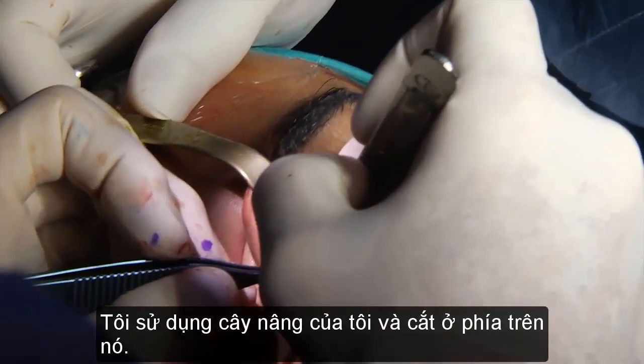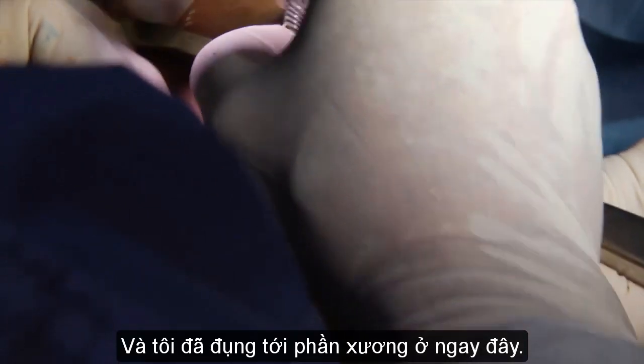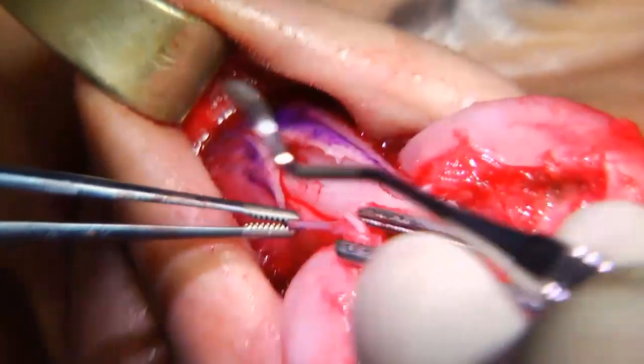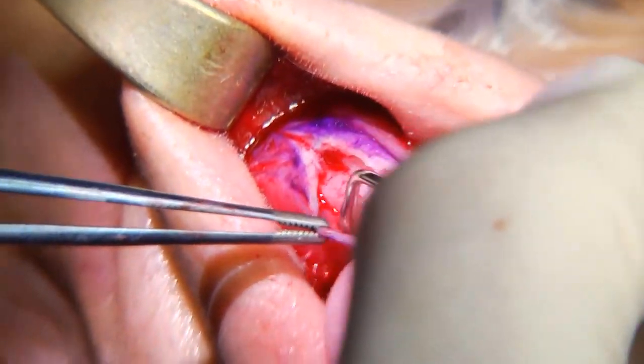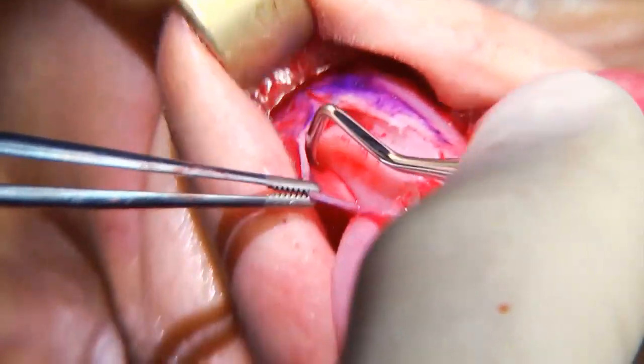So I'm using the elevator, holding it still, to cut on top of it. And I hit the bone here. It's a sizable flap. And see the beauty of the dental elevator?